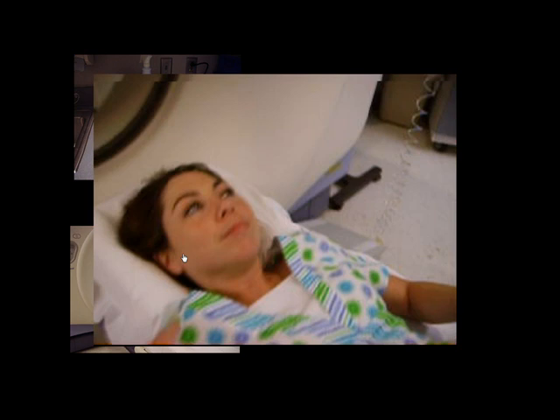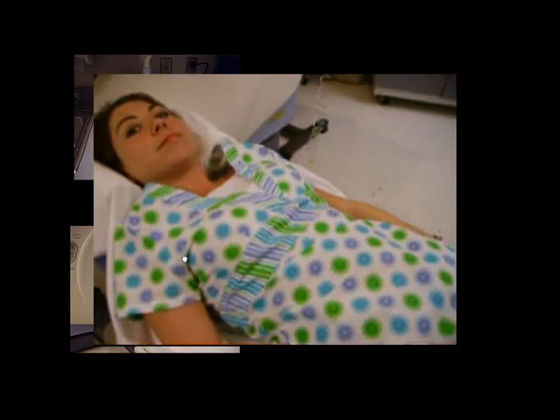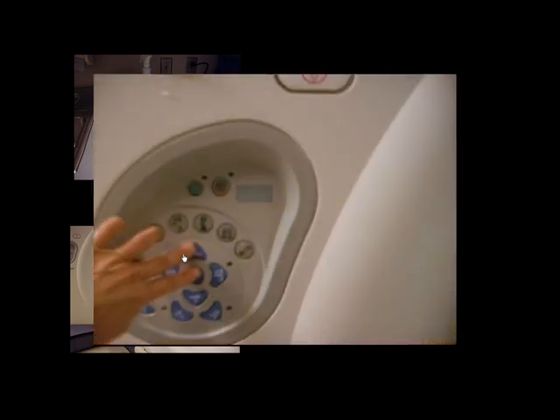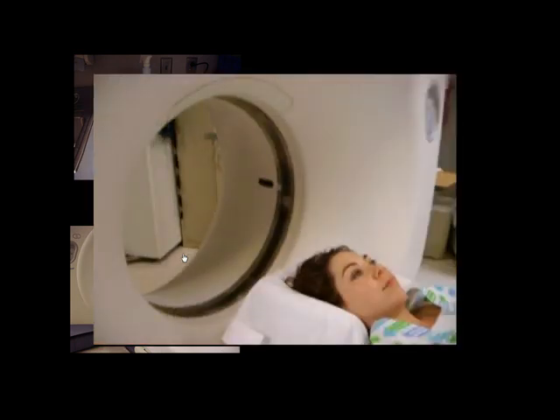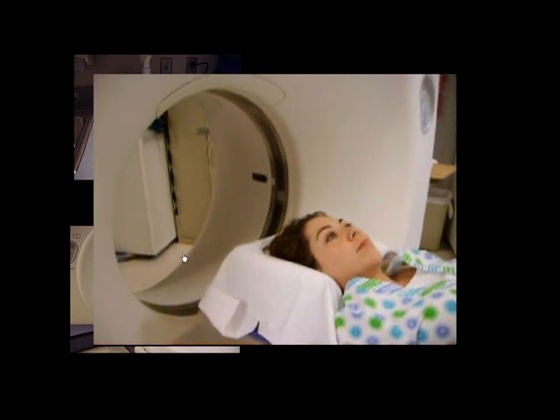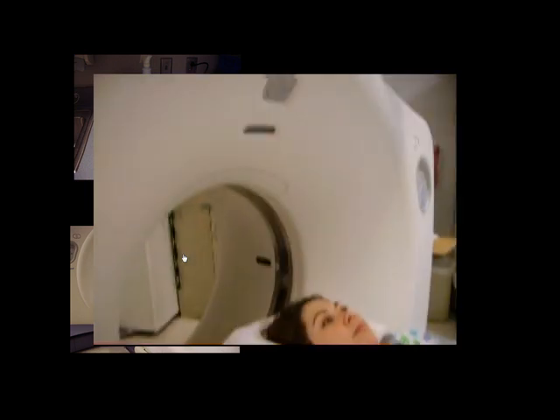I'm going to lay the patient in a supine position, which is flat on their back, with their head in the positioning pillow, their arms across their chest to help keep their arms steady and keep there from being any movement. There's a series of buttons on the gantry that you're going to push. Some will help you move, some will help you use the lights. We'll go over that a little bit later, but here we're moving her up.